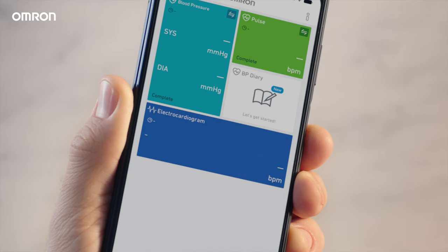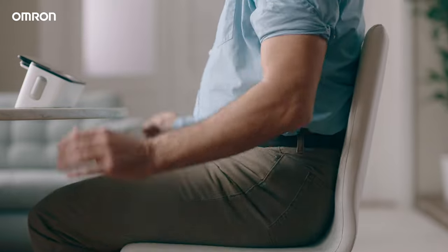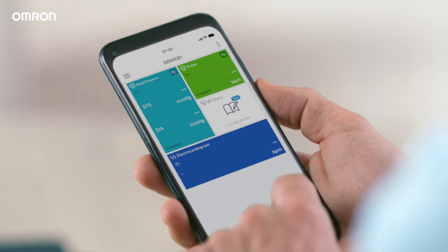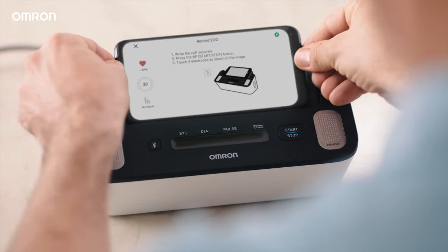Enable Bluetooth and open the app following instructions for pairing. Sit upright. Wrap the arm cuff firmly in place. Tap record on the Omron Connect app and place your smartphone on the cradle.